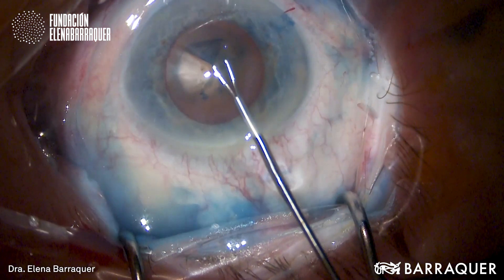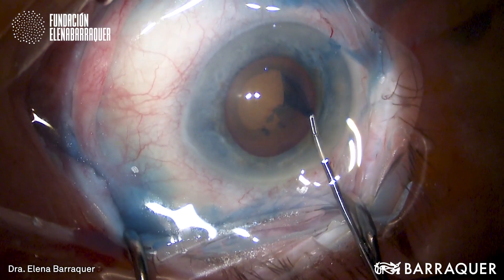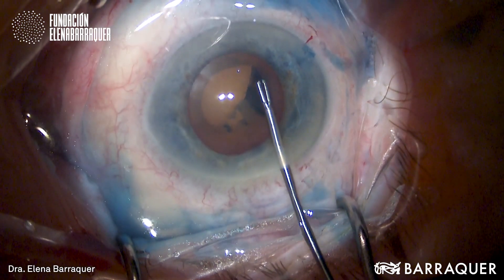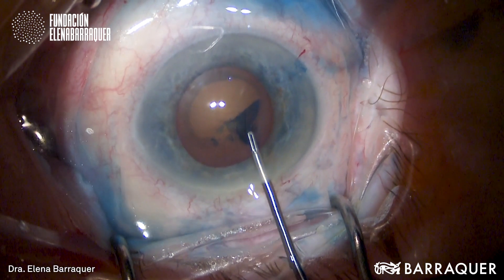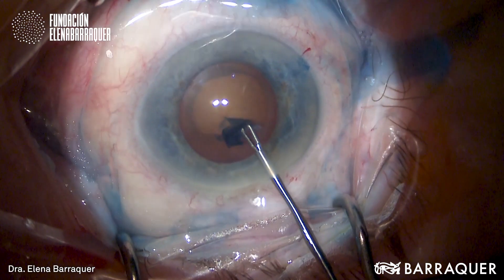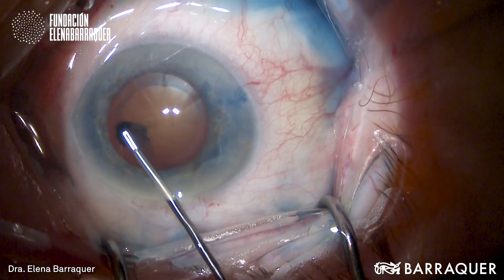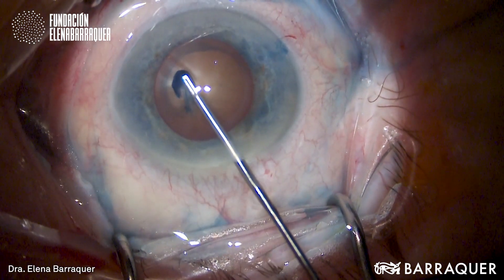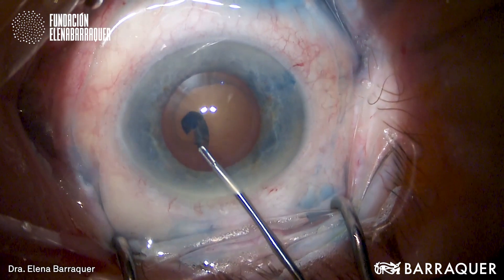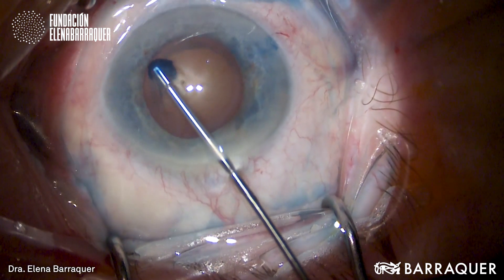But if we had not stained the anterior capsule, it could have been quite difficult to perform this capsulorexis successfully. It's also important to have a product like Vision Blue with very high purity standards, because if not, the staining is not going to be even — it's going to get blotchy, and in some cases it's even worse than not having the capsule stained at all.